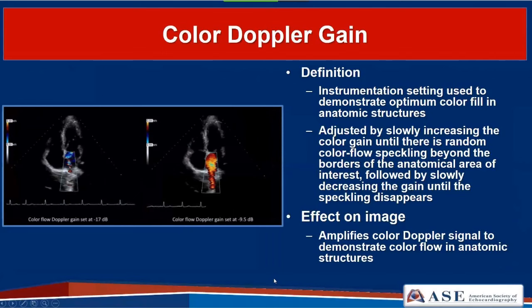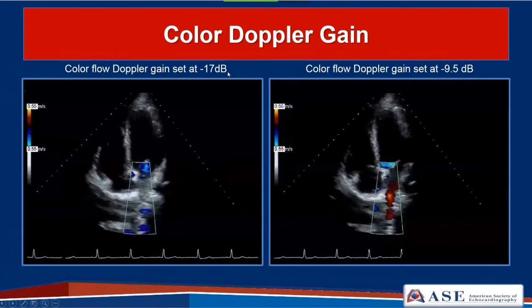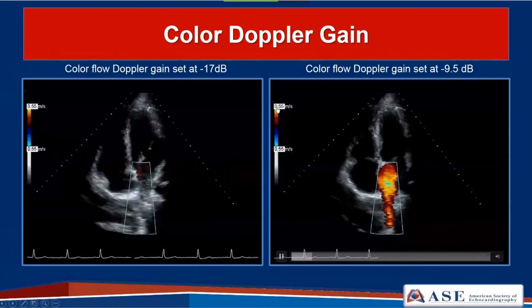The color Doppler gain feature is used to demonstrate optimum color fill in anatomic structures. To optimize it, start by turning your color gain all the way up until you see speckles just outside your area of interest, then slowly turn it down until you have fill within the structure of interest with no more speckling outside. It amplifies the color Doppler signal to demonstrate color flow. For example, imaging the pulmonary vein at minus 17 dB gain shows no fill; increasing gain to minus 9.5 dB allows the pulmonary vein to fill in—without changing the scale at all.